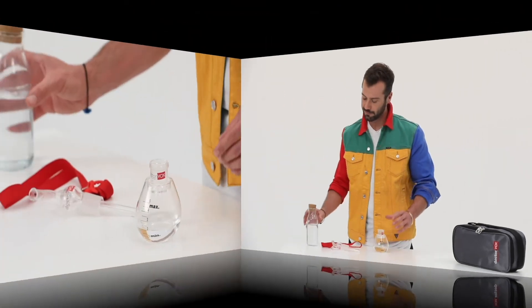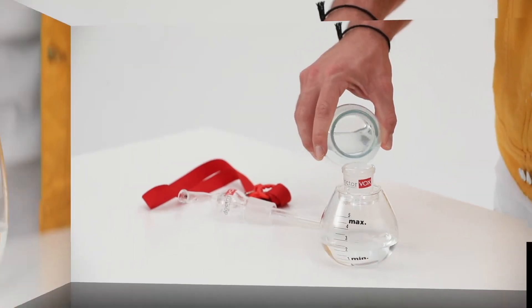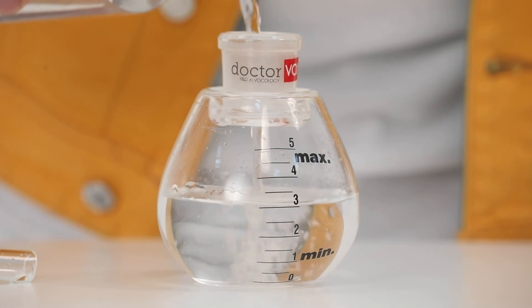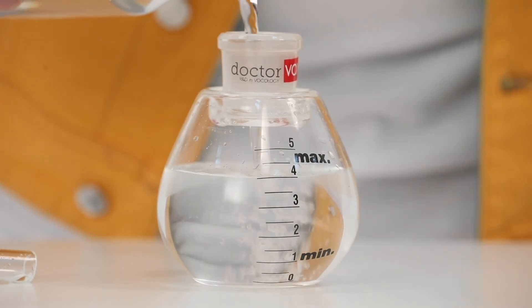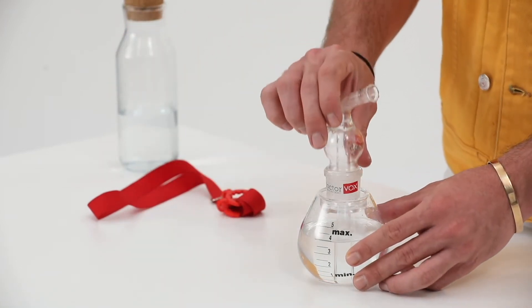After the voice has been warmed up and prepared, the water level can now be higher. The water level is adjusted to the 4 or 5 centimeter depth of the device. These water levels are the levels at which the massage effect is the greatest.